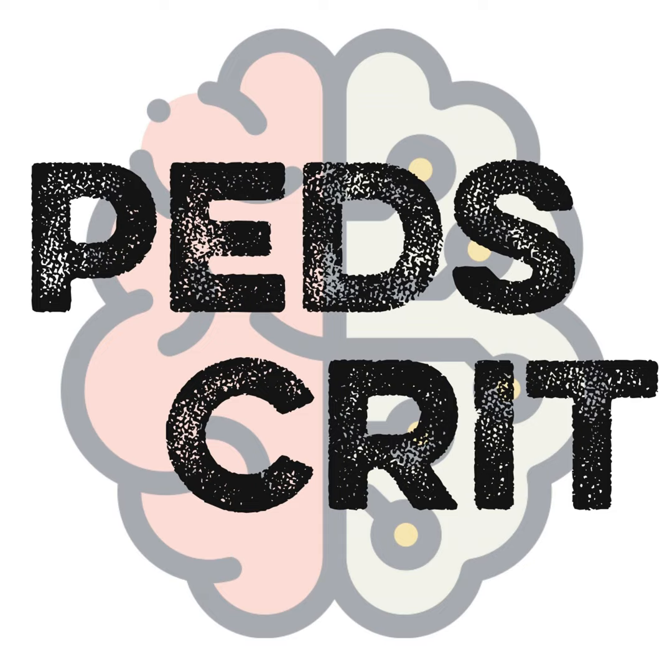I really appreciate that and needed to hear it early, because in my mind, it's very hard to just sit and wait for the lungs to recover. So giving a little something to look for every morning at x-ray rounds, like seeing that air bronchogram new from yesterday, is very positive. And as those branches branch other branches, you get excited and you start to say, well, maybe I'll try a little bagging at a pressure of 30 today and just see what they do. And then you see if they develop tidal volume or get an end tidal waveform.